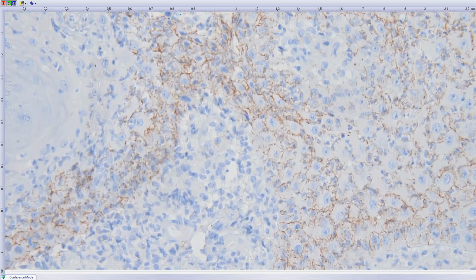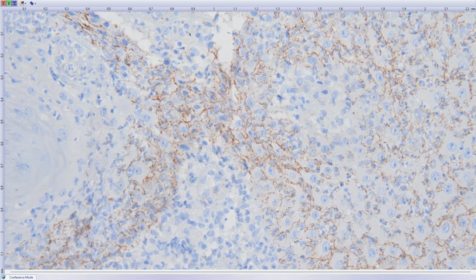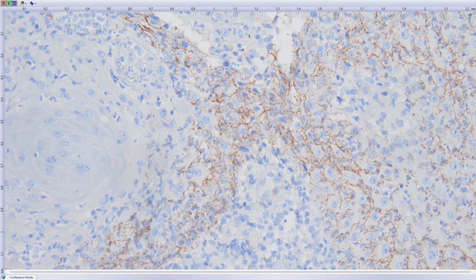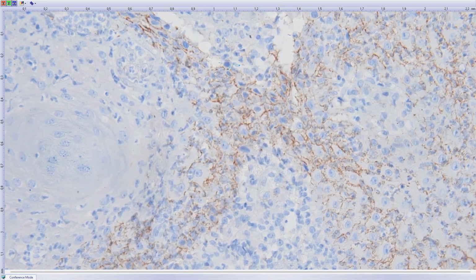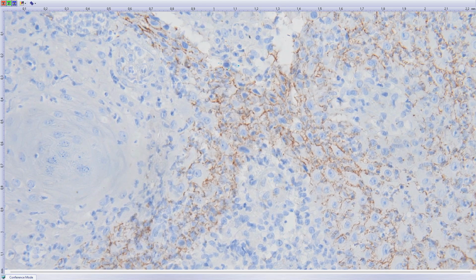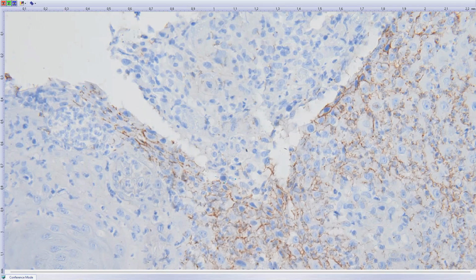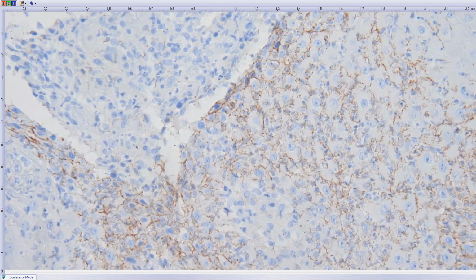So it's syphilis, or condyloma latum, with this pronounced epithelial proliferation, which if it's cut not perpendicularly may lead you to an erroneous diagnosis of well-differentiated carcinoma. So always be careful and think about syphilis, because it's not that uncommon to see cases still today. In fact, it's epidemic in Europe and the rest of the world.